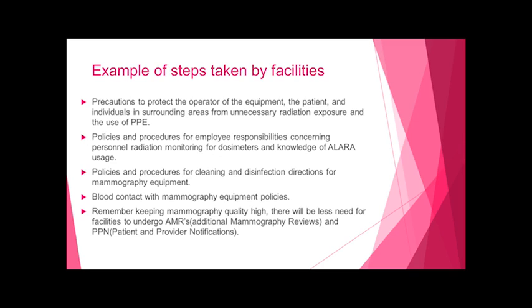Policies and procedures for cleaning and disinfection directions. If you have 2-minute wipes compared to 10-minute wipes, that has to be documented also. Blood contact with mammography equipment policies, like doing post-procedure mammograms. Patients can bleed. You have to have a blood kit nearby if it's a lot of blood. So you have to document when you wipe off blood. That has to be documented in mammography as a law.